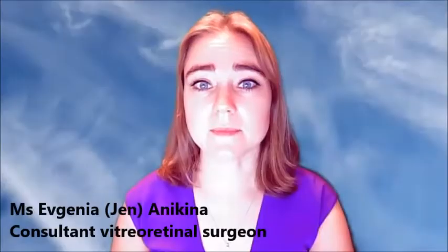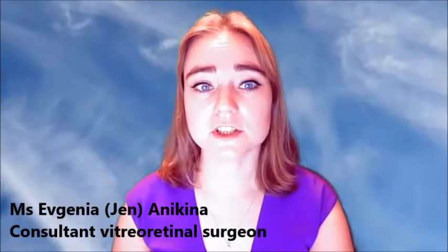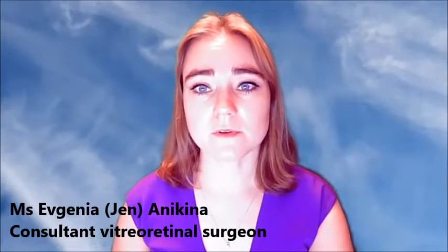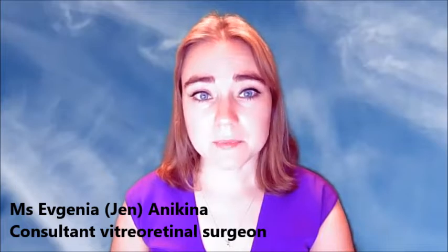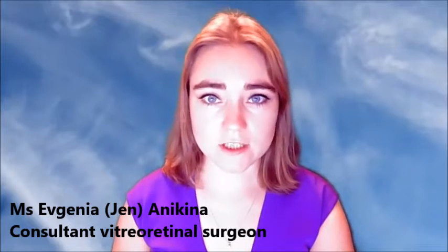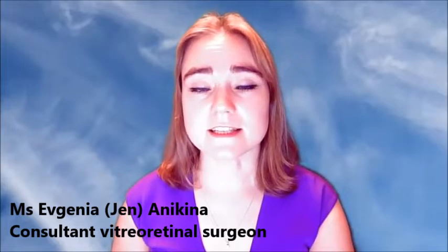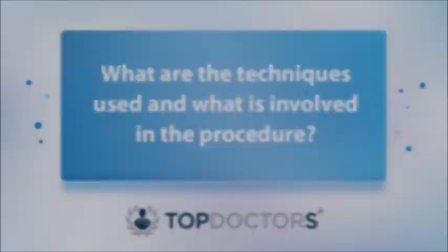Secondary lens is recommended if your specialist thinks that you could achieve a visual improvement or relief from troublesome symptoms through having this surgery. You may be offered a trial of contact lenses first, if this is relevant in your case. This helps us to decide if a secondary lens implant will be helpful.